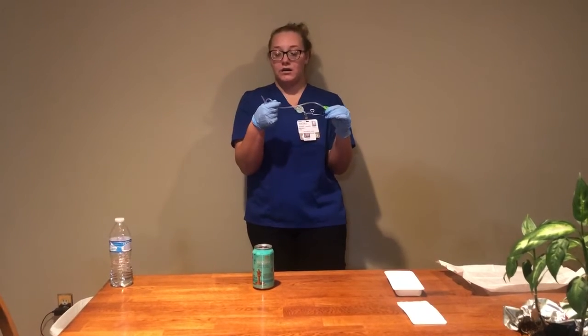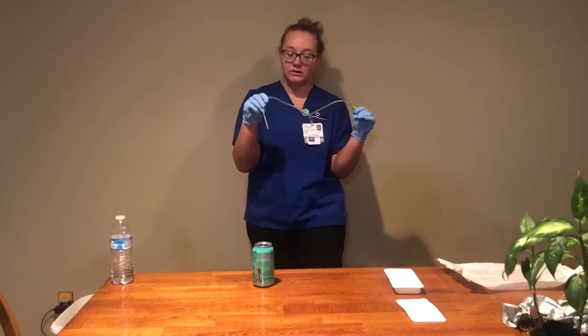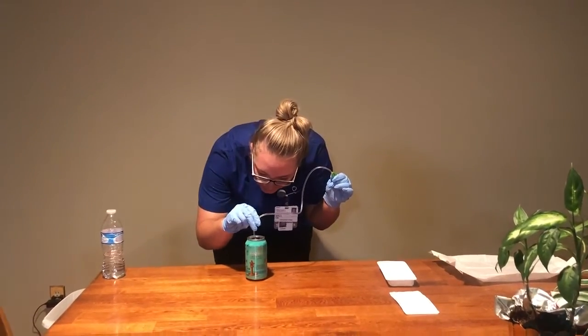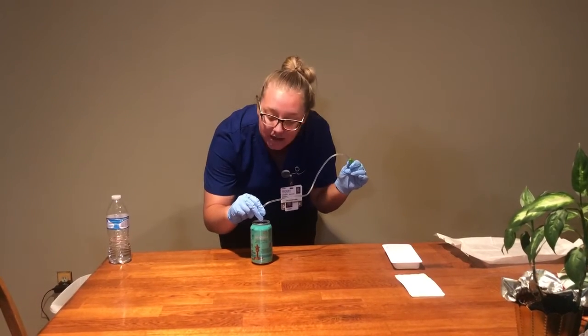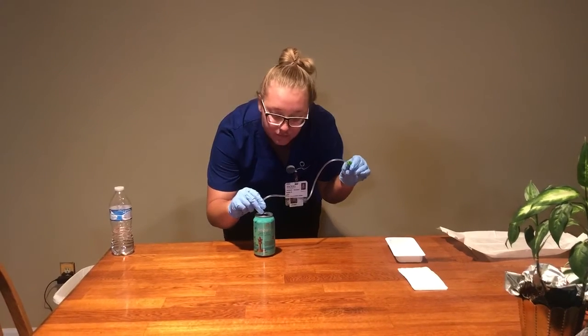So then after that, I'm going to stretch this out, and I'm going to put this into my trach. So I'm going to put this in 6 to 8 inches, or until my patient coughs or I feel resistance. And then I would make sure that I'm not covering the port.